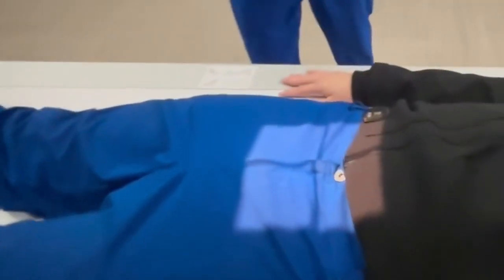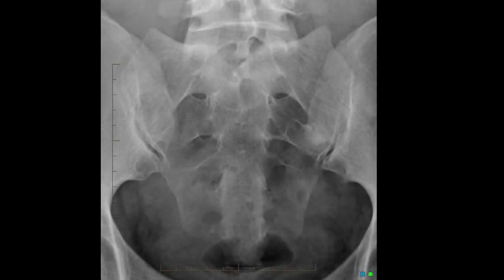Have the patient suspend respiration and take the image. The image should be free of any obstructions in the lower bowels. The image should demonstrate the entire sacrum, SI joints, and L5-S1 intervertebral joint space. There should be no rotation on the sacrum, demonstrating the sacrum free of foreshortening. Correct angle and alignment of the CR will show the pubis and sacral foramina are not superimposed.